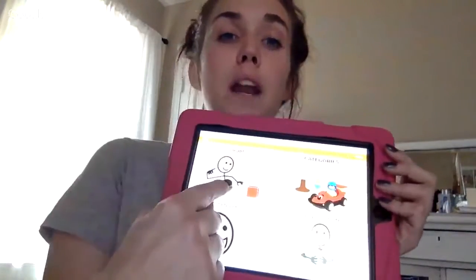You start out with a mand training session with a single icon that the child presses. Press Cheerios, it repeats back "Cheerios." The staff then says, "I want Cheerios," and delivers the Cheerio immediately upon the child requesting. A lot of times the children get very quick at understanding that contingency: press this button, Cheerio, receive Cheerio.